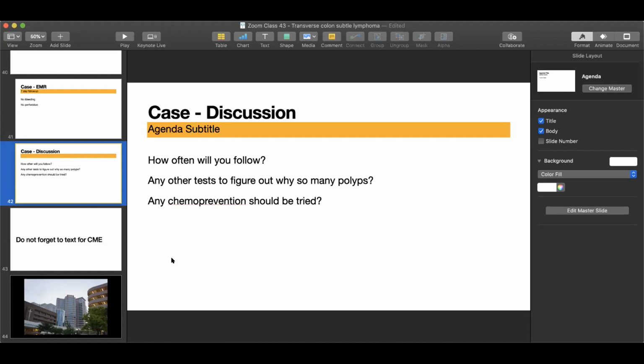The other thing is that because the lesions she has are like SSA of the 2B type, they are notoriously very difficult to find. I would actually perform a chromoendoscopy using indigo carmine next time, specifically looking for completely flush-to-the-wall lesions, the 2B serrated. I would use a cap and look carefully, because I think she probably has more, and there's also a possibility of a residual at the resection site.